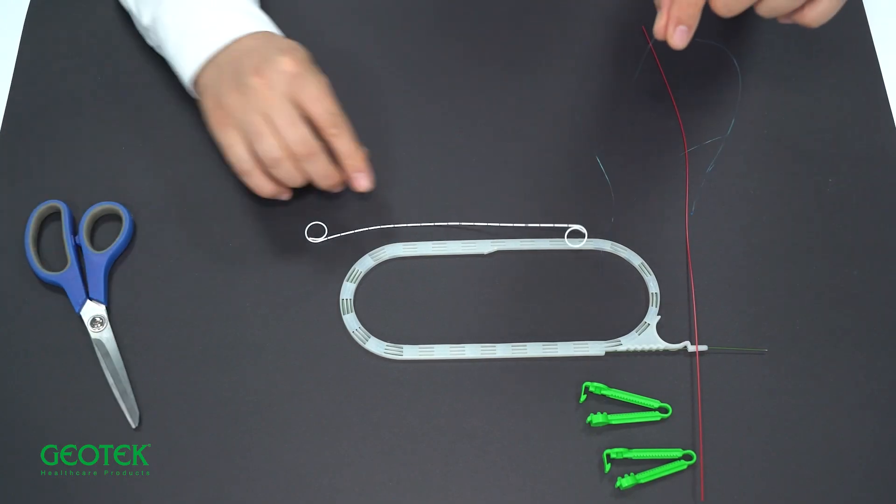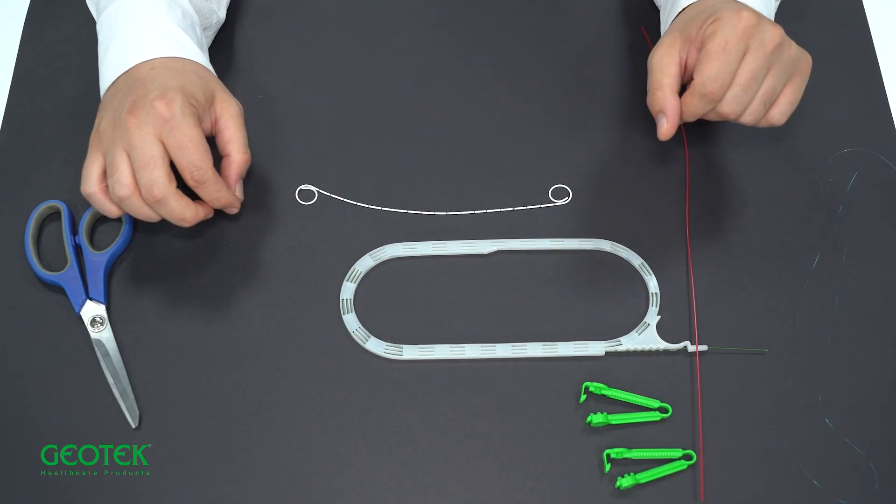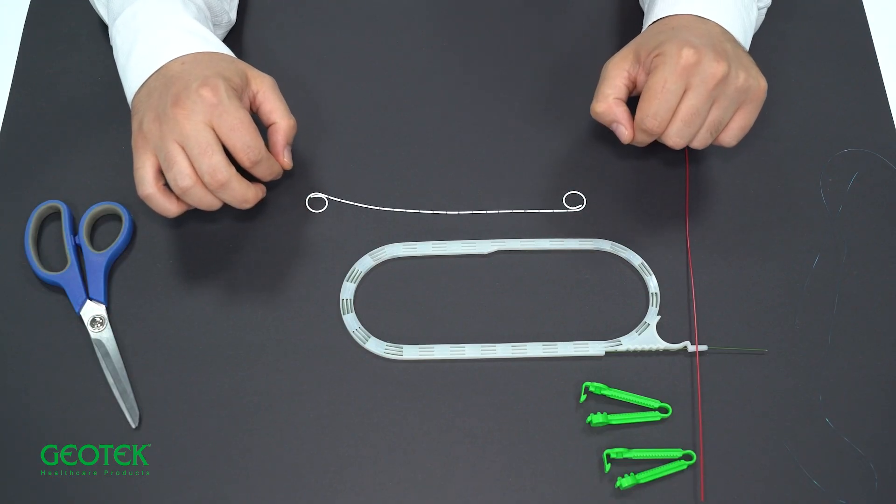When stretched, you can disrupt the curved ends of the double J stent, which is called pigtail in English. Stretching is therefore not recommended.